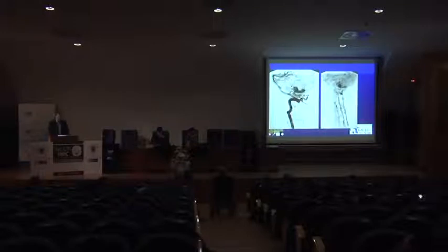And here you see why he has all that change on his upper cervical spine. You see the draining pattern here of this fistula. So when you go to his surgery, because we failed embolization, surgery can seem very complex.